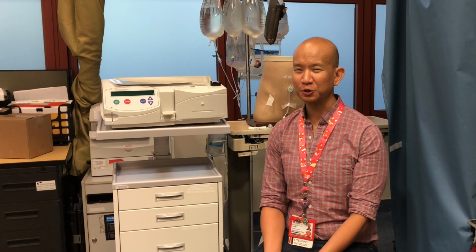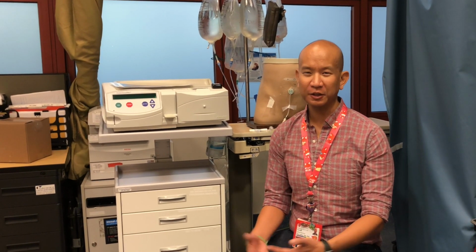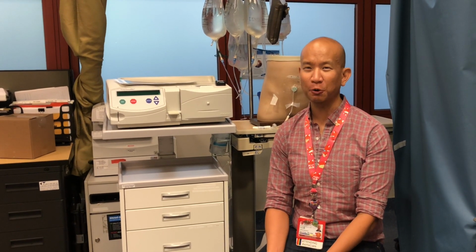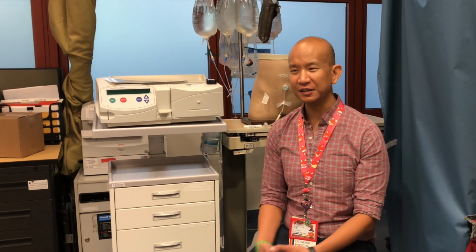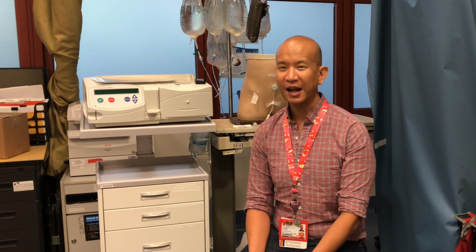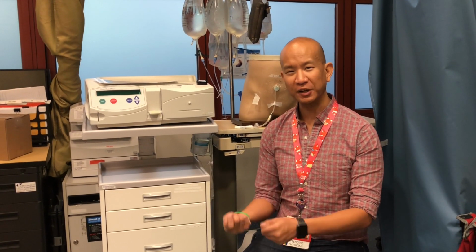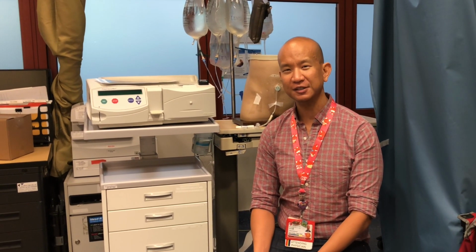There are several common obstacles that patients face when doing peritoneal dialysis at home. Number one, there's quite a bit of volume of supplies that are needed that have to be kept in the home. That includes boxes of dialysis solution, tubing, and disposable sets that need to be changed out with every dialysis session, as well as maintaining sterile technique when setting up the dialysis machine, as well as connecting the patient to the dialysis in order to minimize risk of infections.